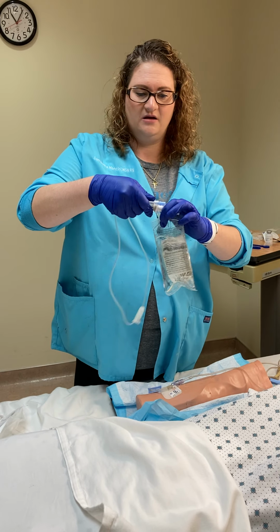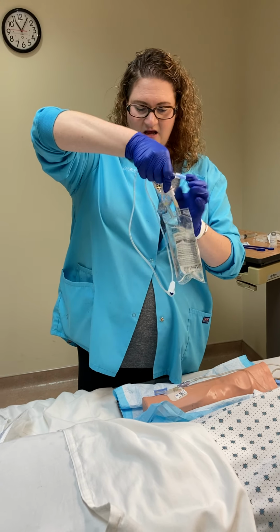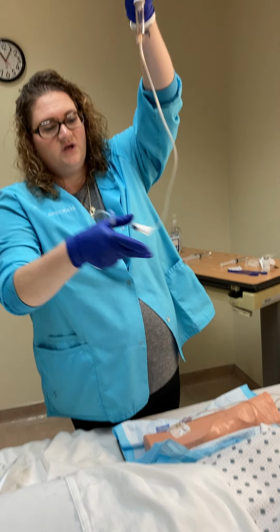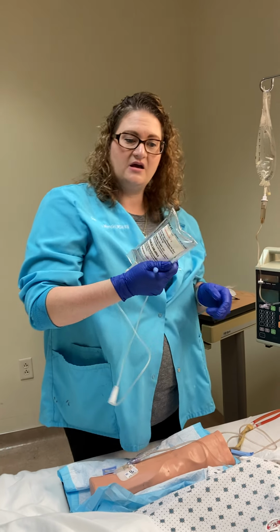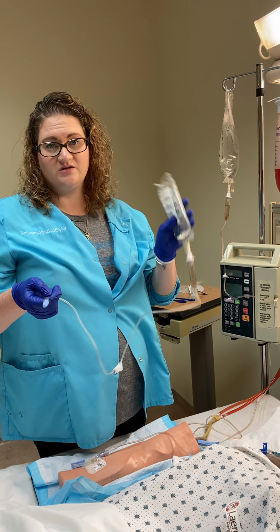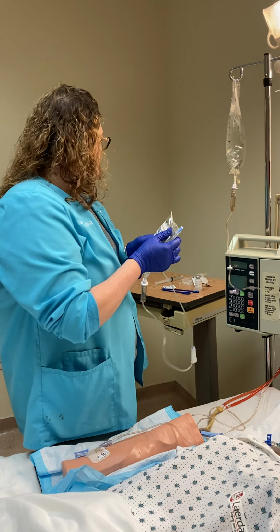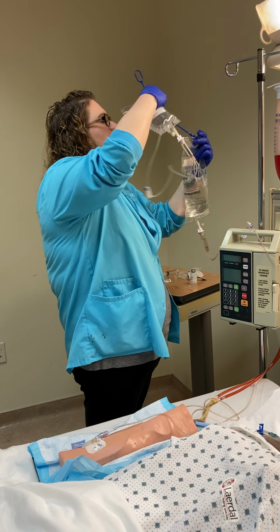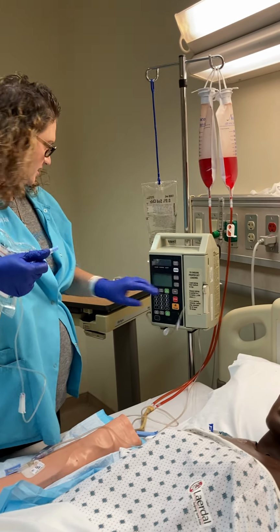Again, I pulled my stopper out of there. I'm going sterile to sterile, and I have my clamp closed because if I invert it, I am going to have it leak everywhere. So with a piggyback, you can actually prime your line a little bit differently, and this is going to help reduce having any medication leak. So what I'm going to do is I'm going to lower my saline. Of course, we did our 3 med checks and all that.